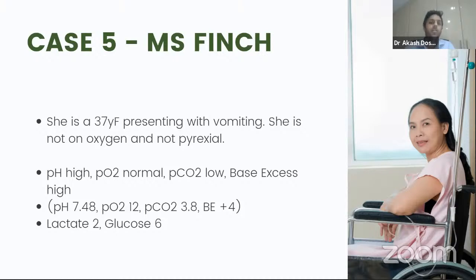R, well, their PCO2 is actually low. That could explain why this patient has got alkalosis. It might be that they are breathing quite heavily, possibly because of pain or possibly because of anything else.